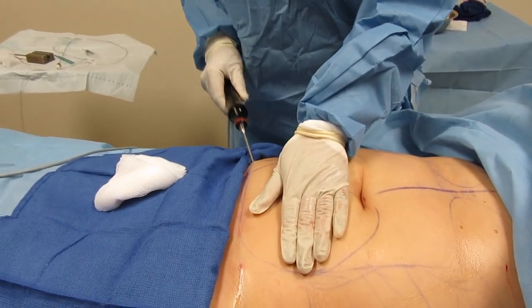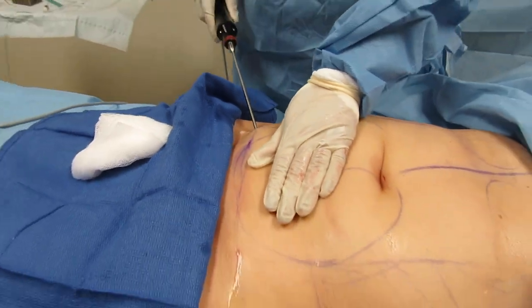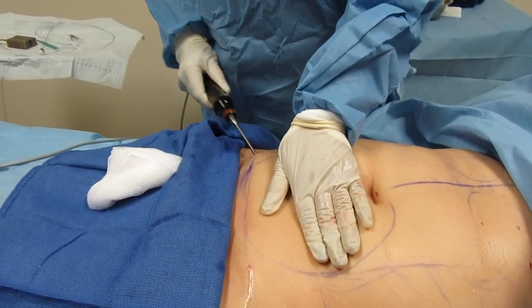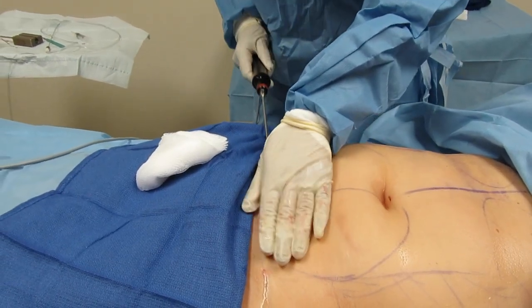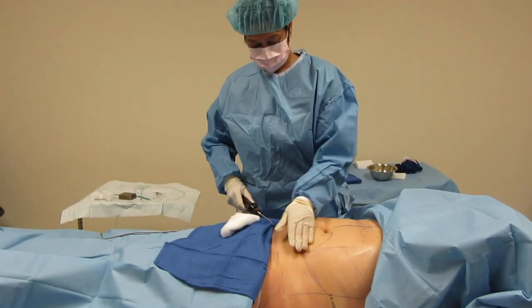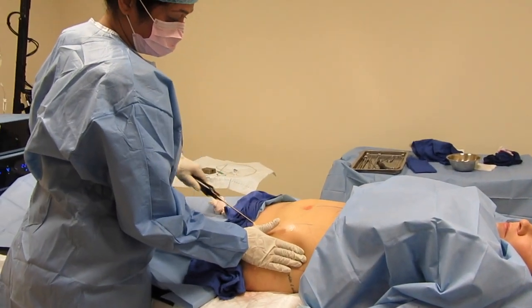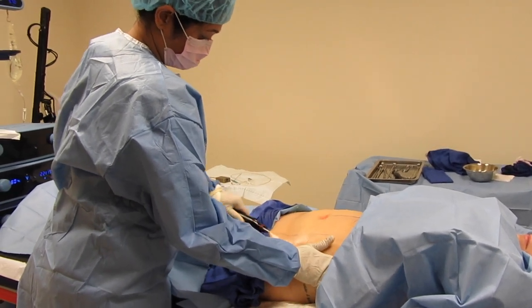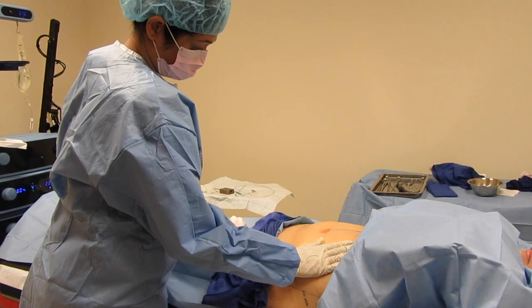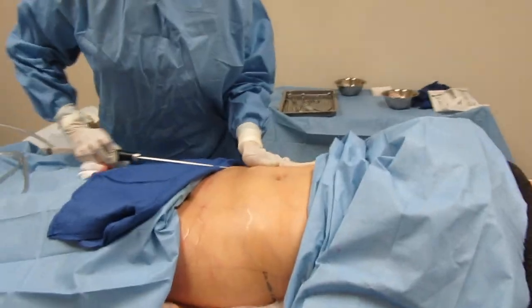And you fan out. And you can see the fat oozing out. Another 20 minutes. Exciting part. Okay, dear, we're going to suction.